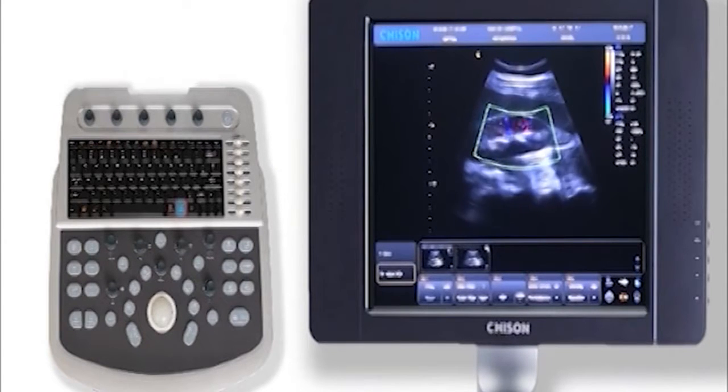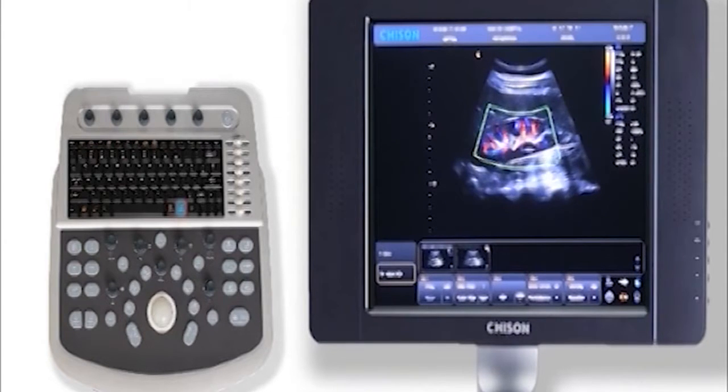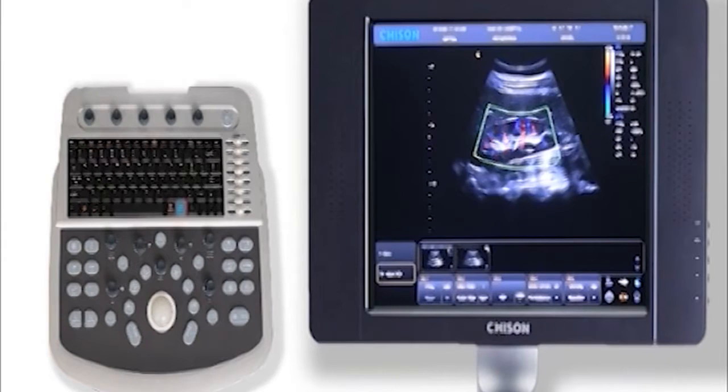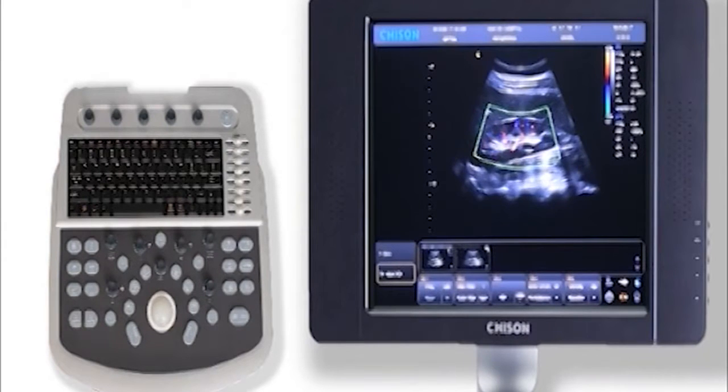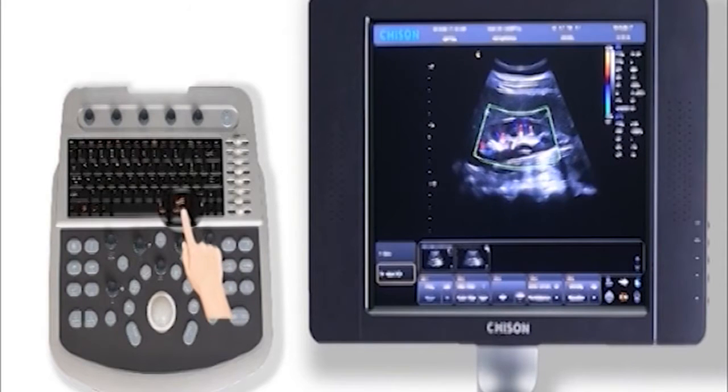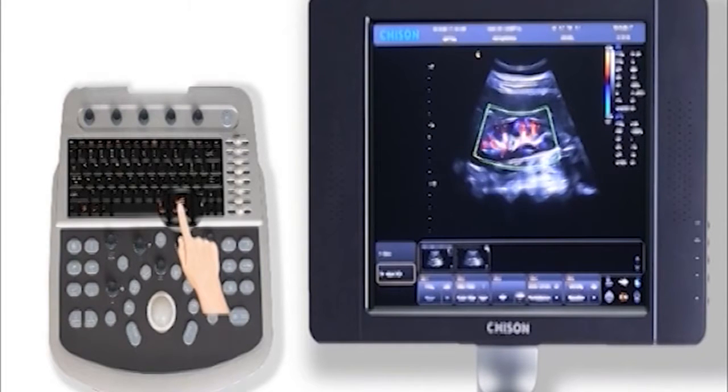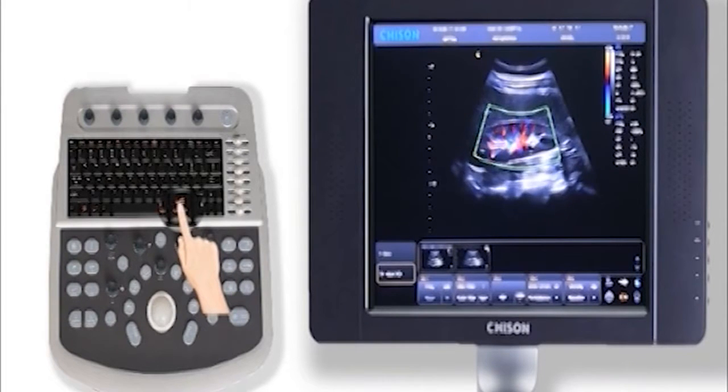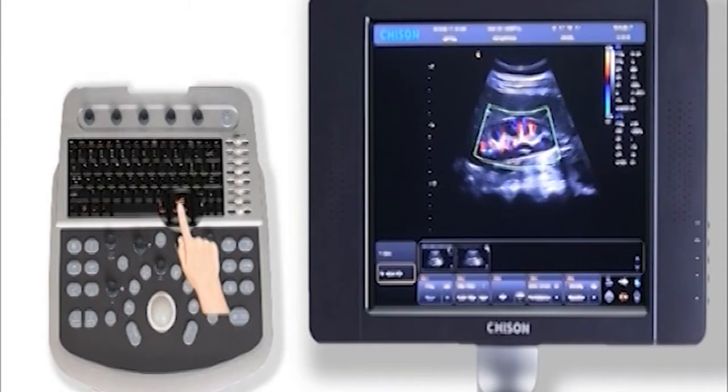Besides, we have one smart technology, Q-Flow, greatly enhanced tiny vessel with low velocity displaying. Now it's off. Click this key, you will see a big difference.